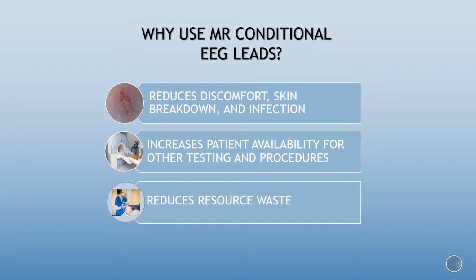MR conditional leads do not have to be reapplied after imaging, reducing the amount of discomfort, skin breakdown, and infection risk for the patient. A patient receiving continuous EEG with MR conditional leads can be transported for other testing without scheduling around the continuous EEG. In addition, MR conditional leads help reduce resource waste, such as time spent reapplying electrodes and technician calls.